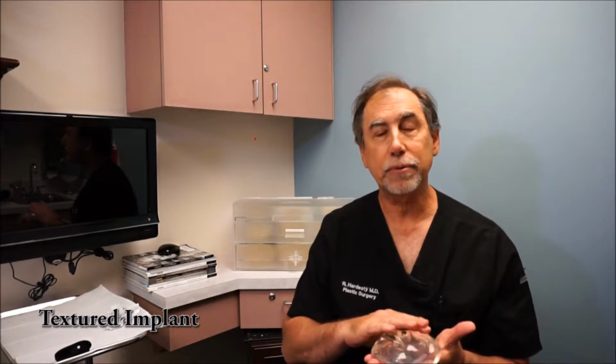Therefore, now we go ahead and remove the implant. We use a textured implant. A textured implant has irregularities on its surface, and the analogy would be Lake Powell. A little known fact, Lake Powell is the first lake on the Colorado River below the Grand Canyon. It has more shoreline than from Canada to Mexico. Why? All the inlets and jetties. This texturization of the implant provides more surface area, therefore less chance of capsule. The only downside is it velcros in and doesn't move quite as naturally.